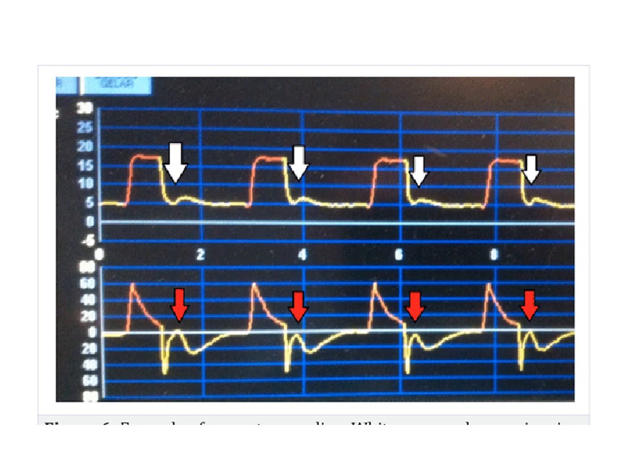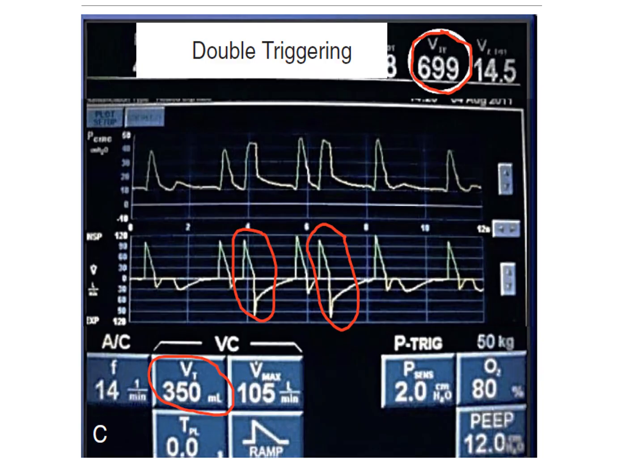And what you can see is the same pattern in all the breaths. So that is one of the clues that this is likely cycling asynchrony rather than reverse asynchrony. In asynchronies, the two most important ones one has to understand, which are very logical and very easy, are flow asynchrony and cycling asynchrony. If you know about reverse asynchrony, it's very good. We always talk about double trigger. Double trigger happens because of the cycling and flow asynchrony, right? So it's not a separate asynchrony.